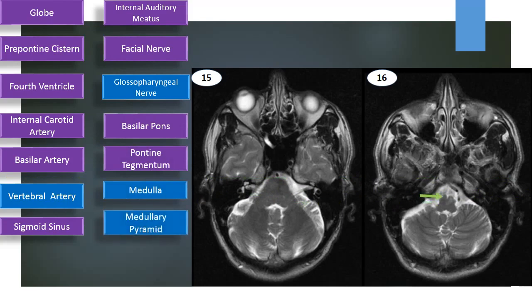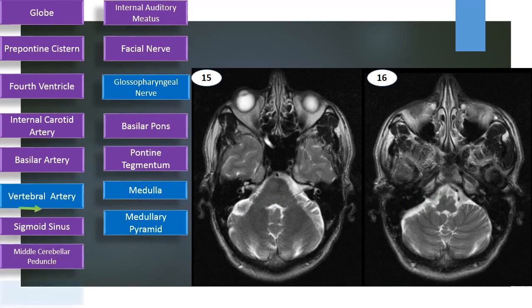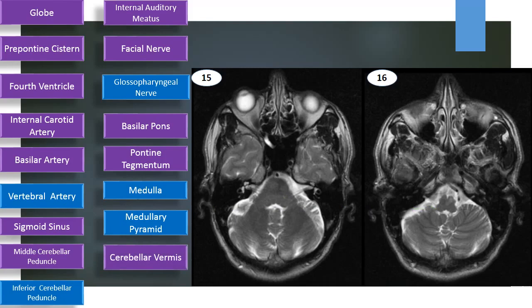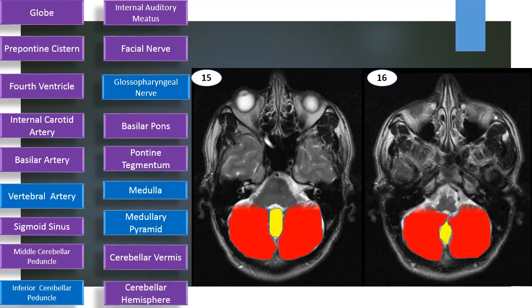Medulla, medullary pyramids located ventrally. Middle cerebellar peduncle connecting the pons with the cerebellum. Inferior cerebellar peduncle connecting the medulla with the cerebellum. Cerebellar vermis and cerebellar hemisphere.